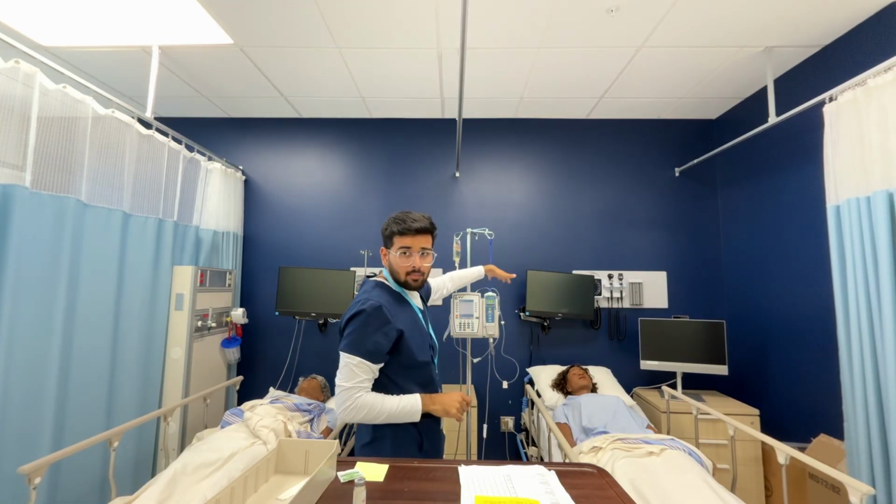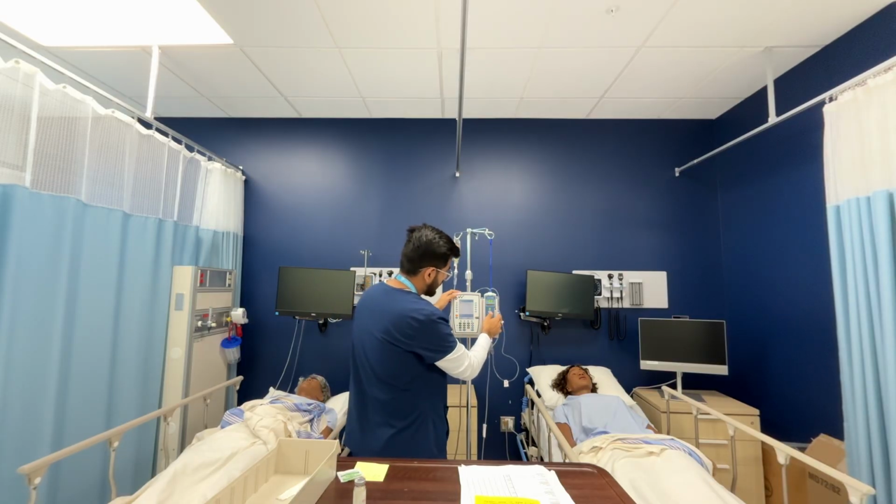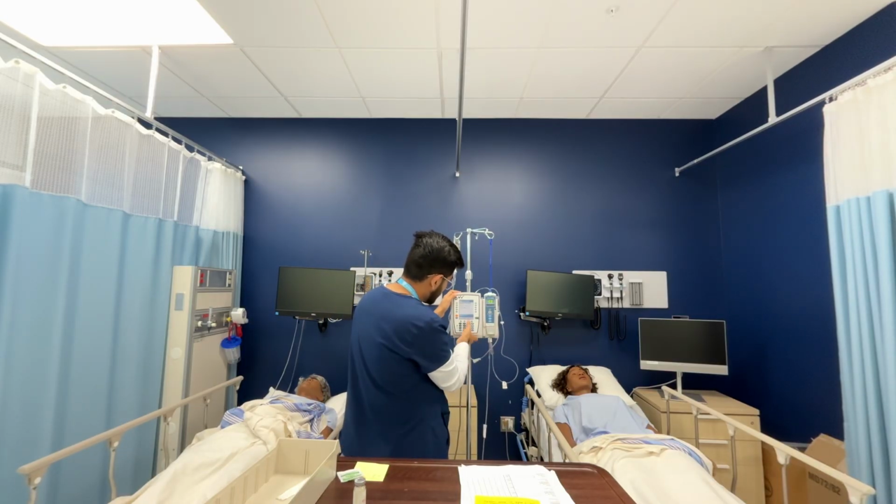I'll make sure the primary bag will go down. It will go up. So this medication can go first. I'm gonna do channel select. I'm gonna go secondary. I'm gonna search for pantoprazole. I selected pantoprazole. I selected yes.